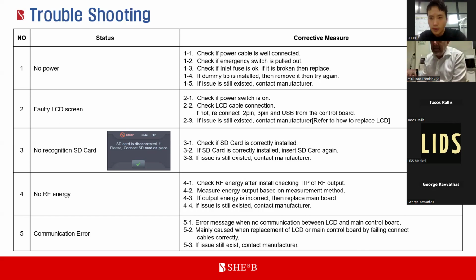Okay. So number 1, when we ship out a Virtue machine from our manufacturing site, we always do quality control, which means that for every energy level and every different frequency, we follow the regulation and the total output should meet the regulation. That is number 1. And after the shipment, we don't need to do any calibration of the RF output or the user interface screen, because it is already fixed in the software. So we don't have to check the RF output after the installation.